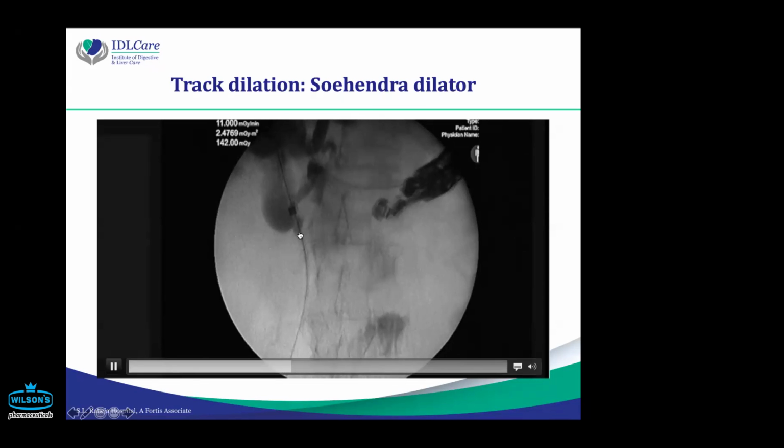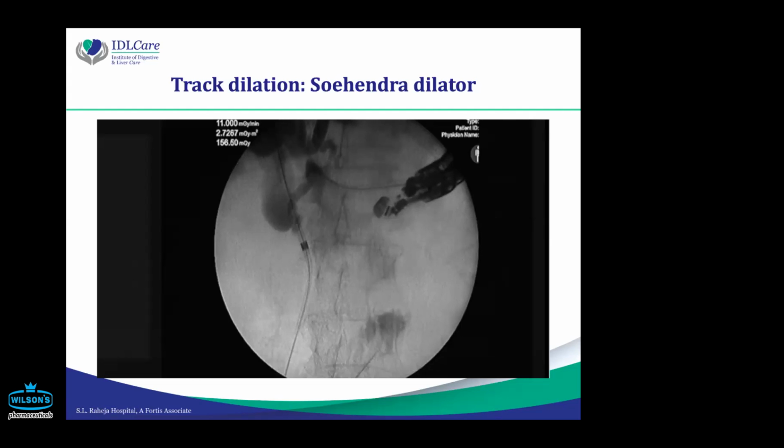Now we are at the stricture. It's a tight stricture, so you have to be careful. See, I am pushing it. If you see my scope position, I am trying to push gently, gently, and then it starts going. It goes across. Once the dilator goes through, stent placement becomes fairly straightforward. It's not a problem at all.